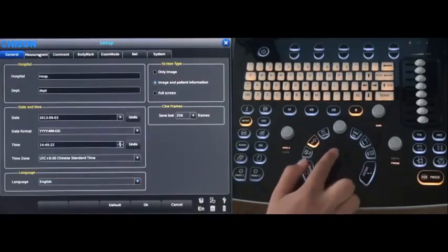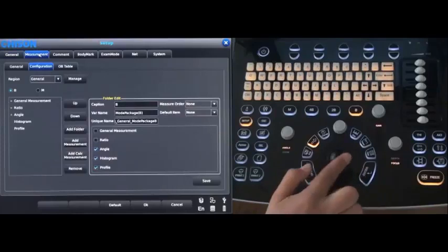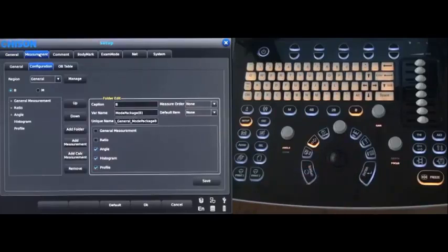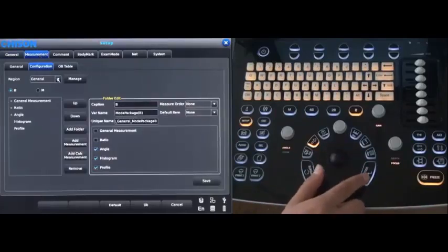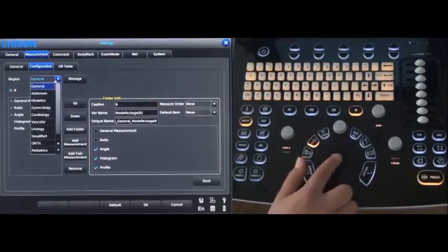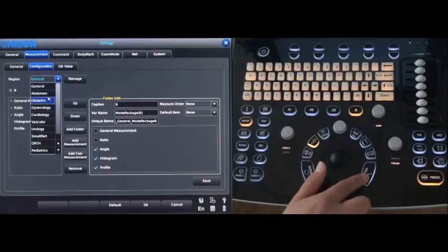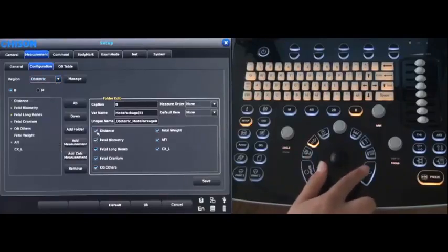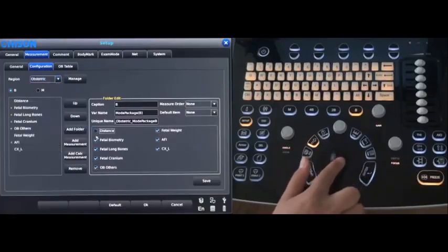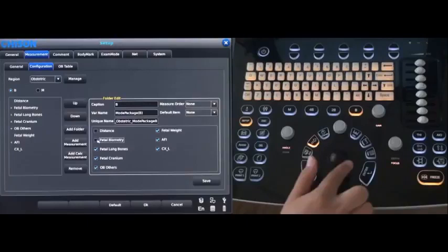Go to the measurement to do the measurement configuration. Choose the OB. You can edit the thing you don't need and save it.